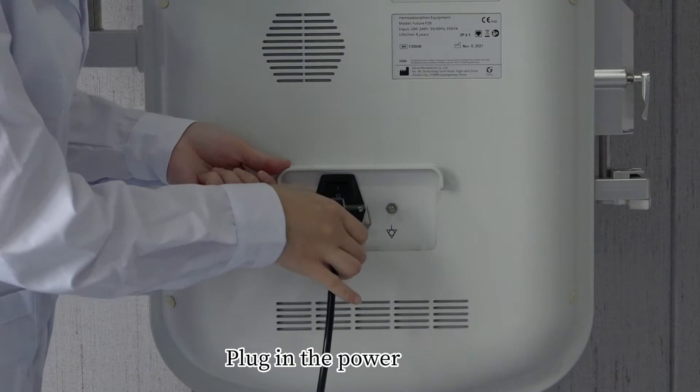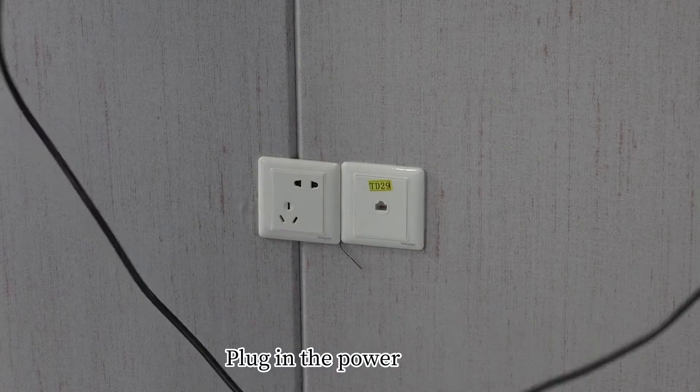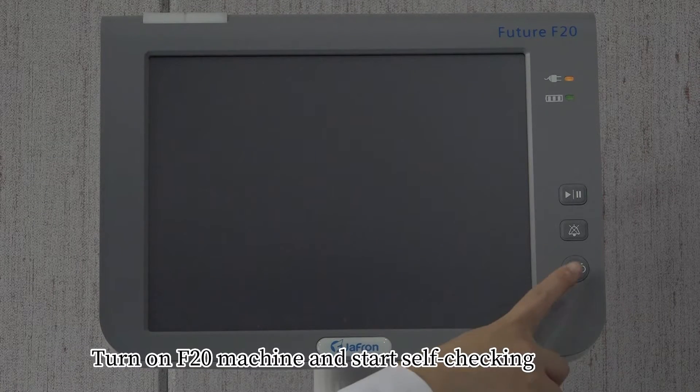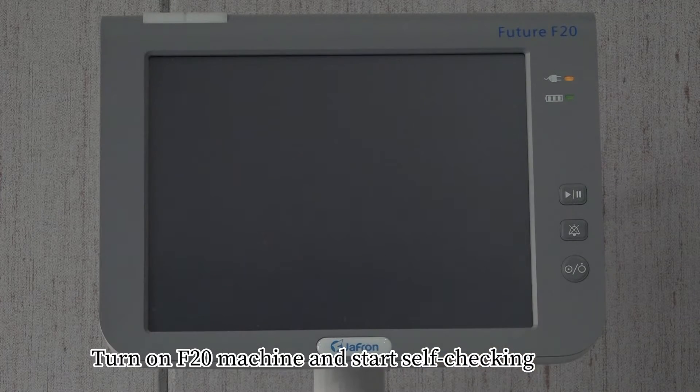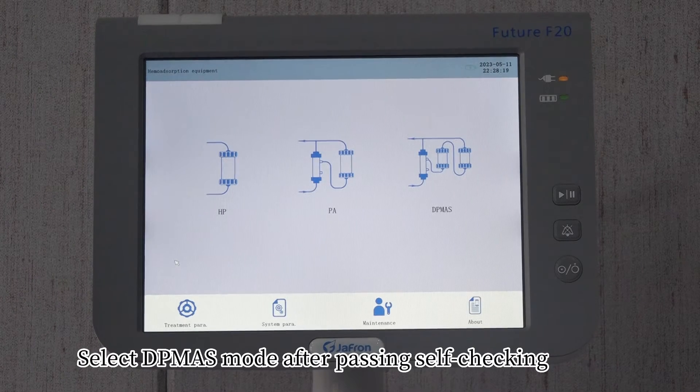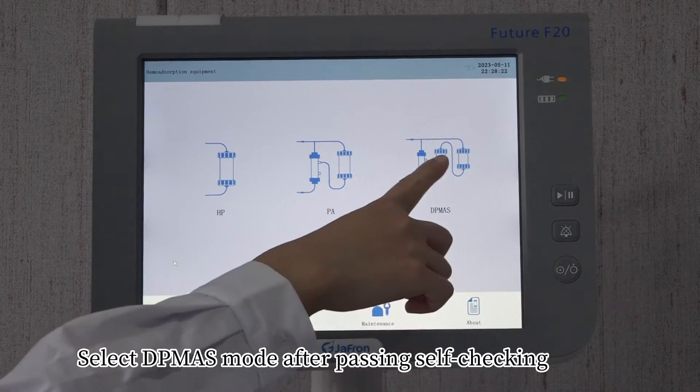Plug in the power. Turn on the F-20 machine and start self-checking. Select the DPMAS mode after passing the self-check.